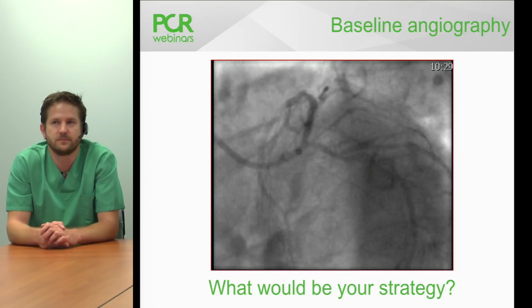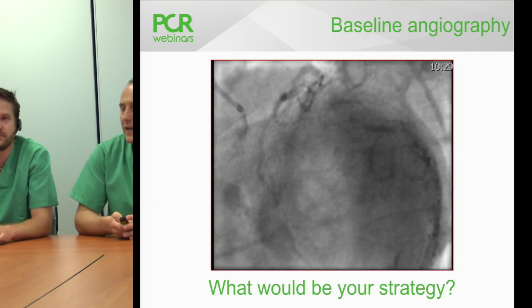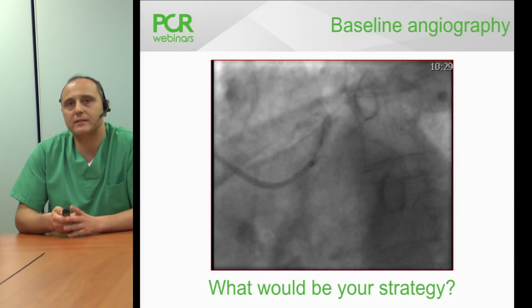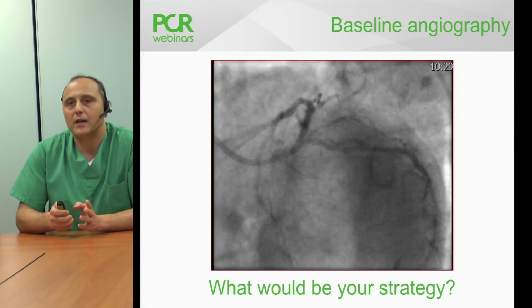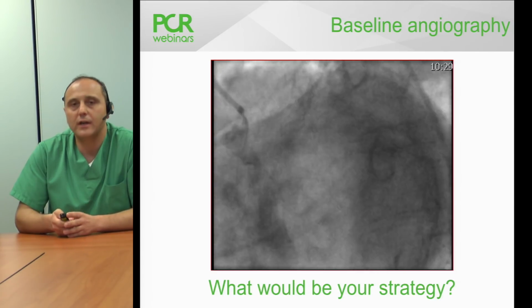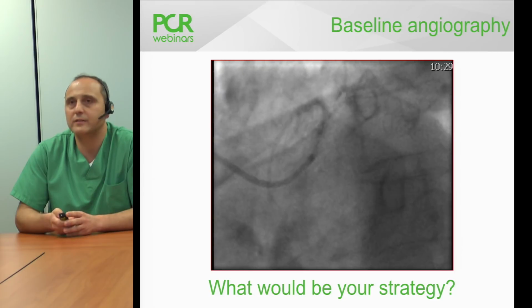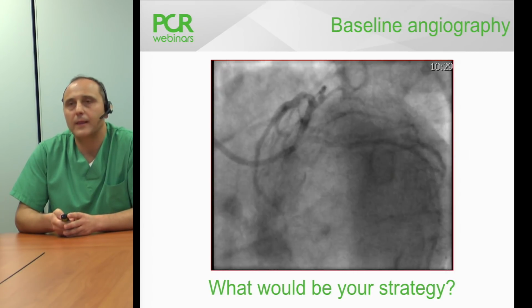But I saw that quite a sizable portion of the colleagues from home do not have the same kind of opinion. So therefore, let me ask the last question for this first part of the webinar. Who among you would rather prefer to start as a first option with intravascular imaging as a tool to assess this left main? Please push on agree if you like this option.